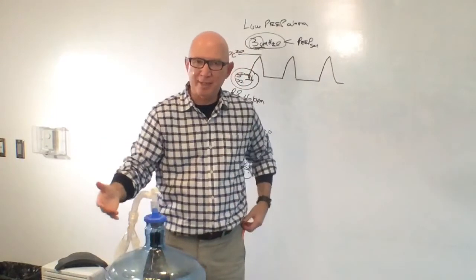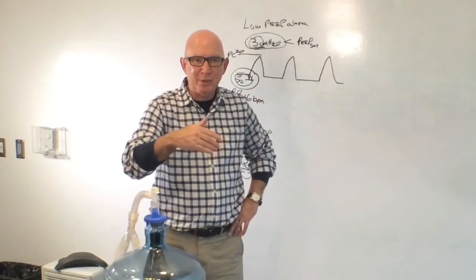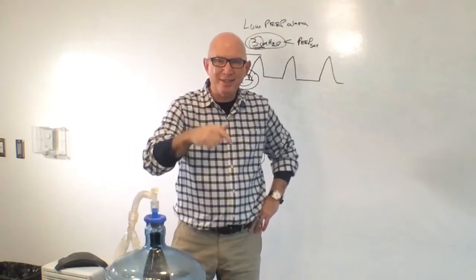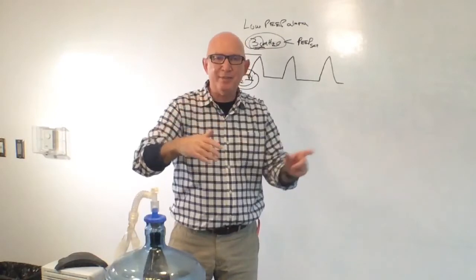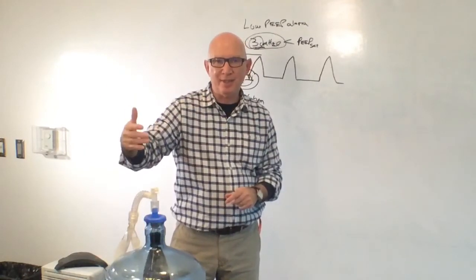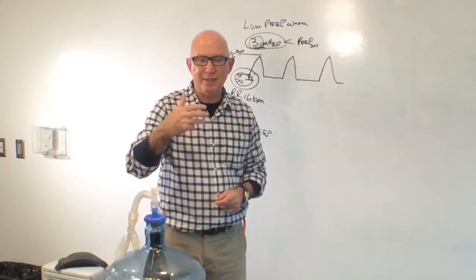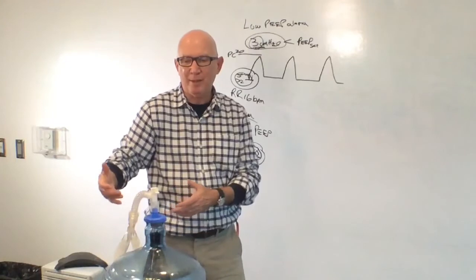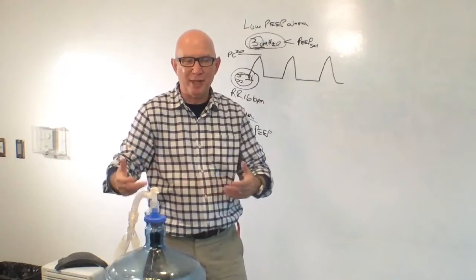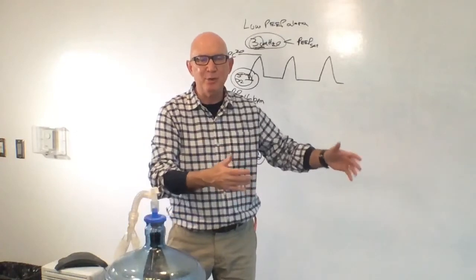And in a ventilator like the LTV, it actually might be a little bit higher based on the type of patients we transport, but in the transport context, typically we're trying to get the patients from a sending facility to a receiving facility safely and ventilated effectively, which requires a certain amount of sedation and analgesics and sometimes paralysis, which allows us to ventilate them in the way that we choose to without a lot of input from the patient. Now, having said that, occasionally we will have input from the patients.